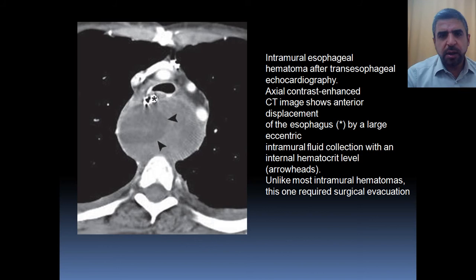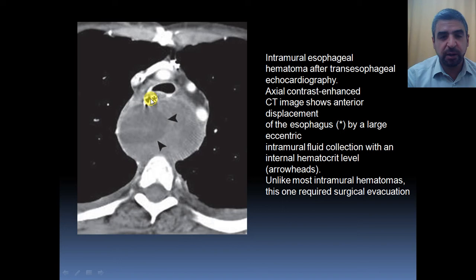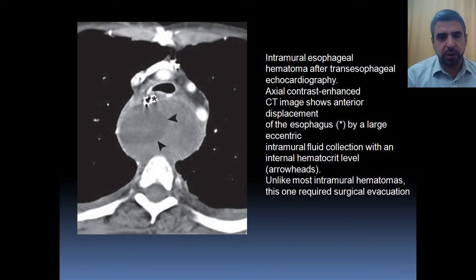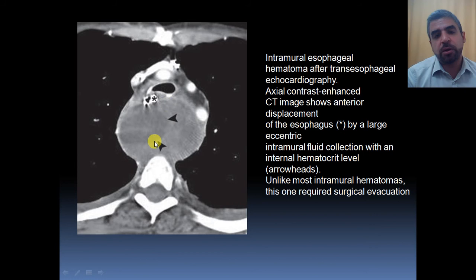For example, you can see here an intramural esophageal hematoma after transesophageal echocardiography. This is the true lumen of the esophagus, and you can see a complex cystic mass within the posterior wall of the esophagus causing mass effect on the esophagus and the trachea, pushing them anteriorly. Within the mass there is a fluid-debris level and a hematocrit level, indicating blood with sedimentation of blood products. This was a large hematoma that required surgical drainage.